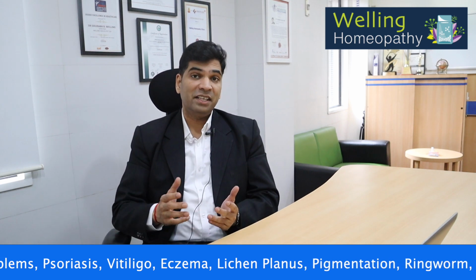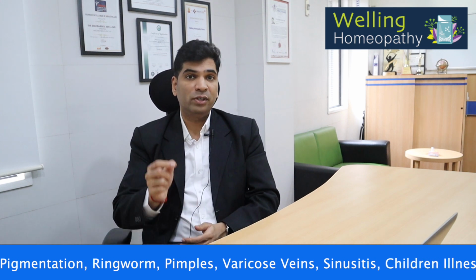Now, if your cycles are irregular, test according to the earliest and the latest dates you are expected to ovulate. It helps to have a kit with several test strips if this is your situation.